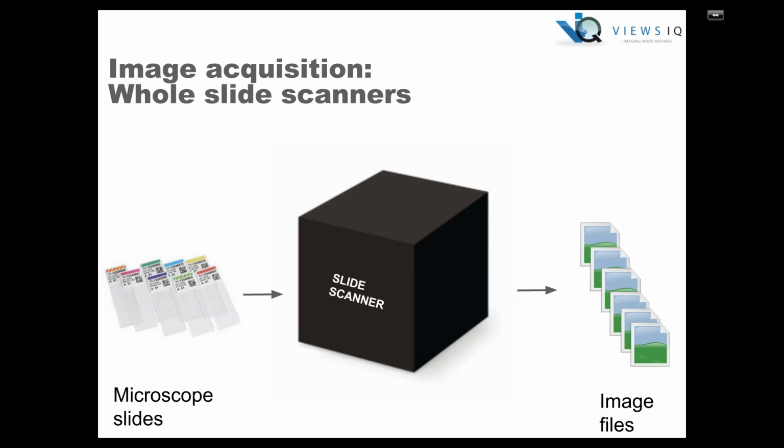So conventionally, whole slide scanners are a necessary part of any digital pathology practice. There are a variety of scanners available now from many different vendors, but all of them follow the same basic principle, which is that you load one or more slides into the scanner. The scanner automatically scans them and generates image files that can be viewed on a computer.